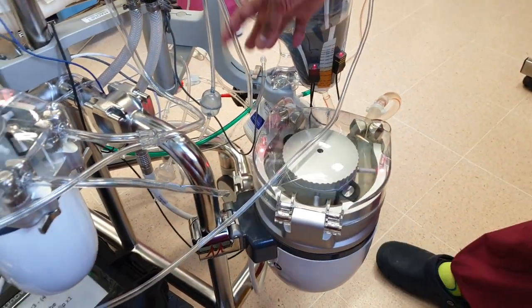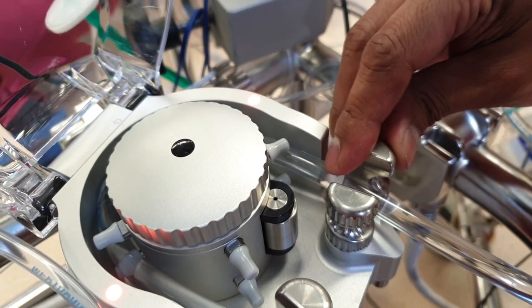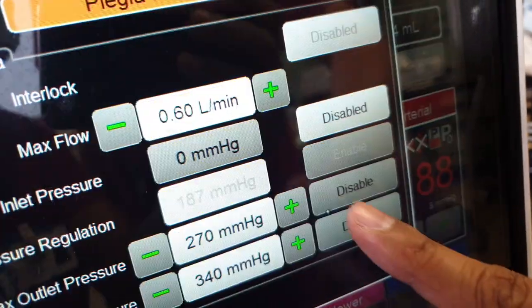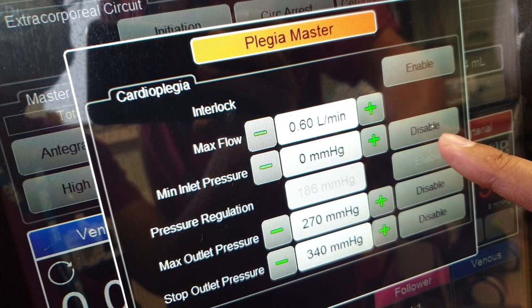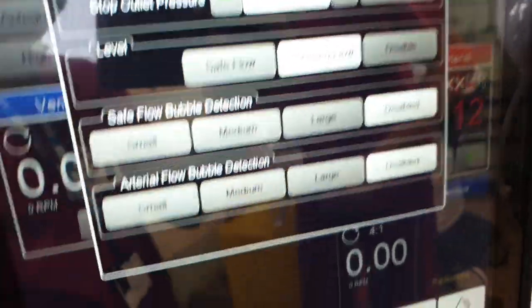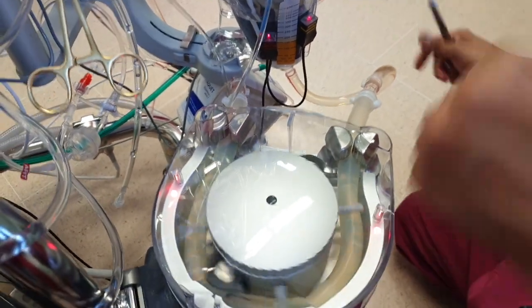And then I will slowly fill it up. You need to lock it first. We call it interlock. So we have to enable it and then protect it. We usually do it in protected. So standard is just put it on protected. Up into the pump, it should stop. So that's a good check. And then when you get the level again, it will go back. So that's a good one.